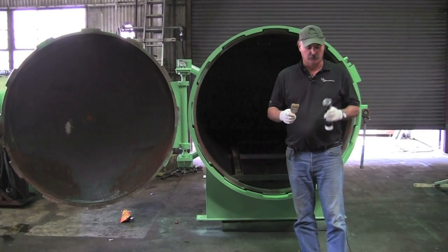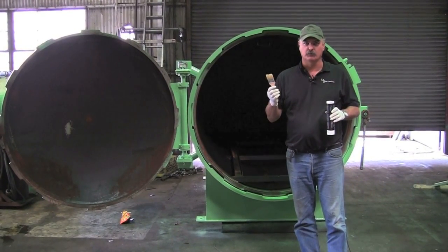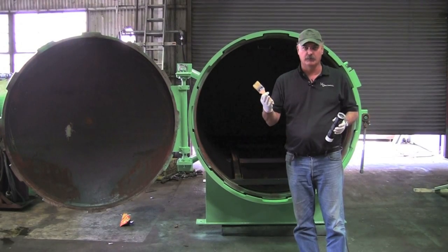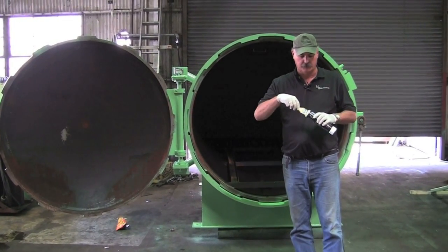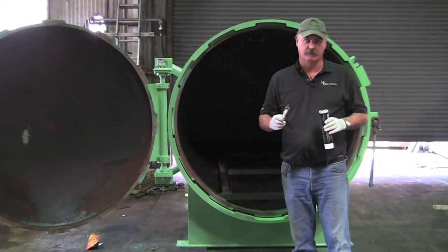When we grease the doors, I'll normally use either a brush, a grease gun, or a rubber glove and get a little grease on it. The first area we want to do is what we call the ring and flange.